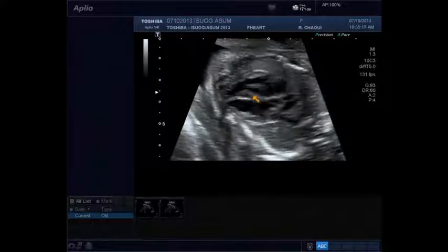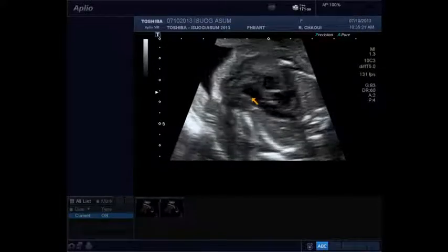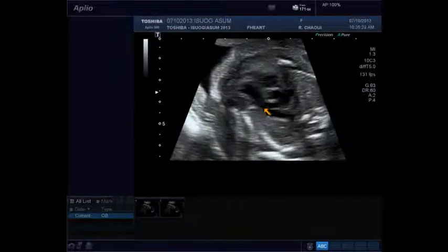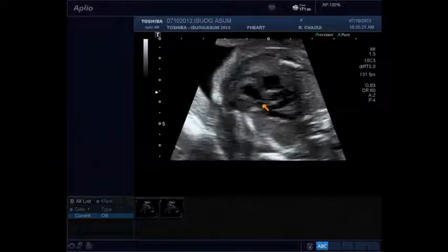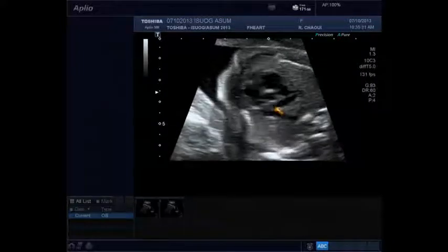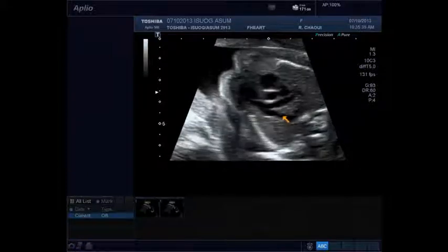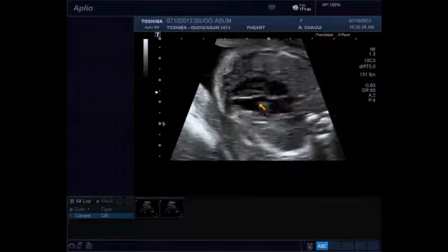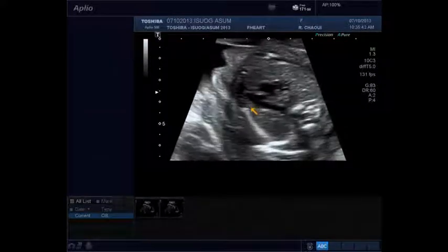And you see this is the right ventricle, and in a more cephalad plane, by moving a little bit up, we recognize how the pulmonary artery is arising from the right ventricle. And by tilting the transducer, you see the bifurcation of the pulmonary artery into the right and the left branch. And we move back to the four-chamber view, and we move slightly parallel to the upper thorax.